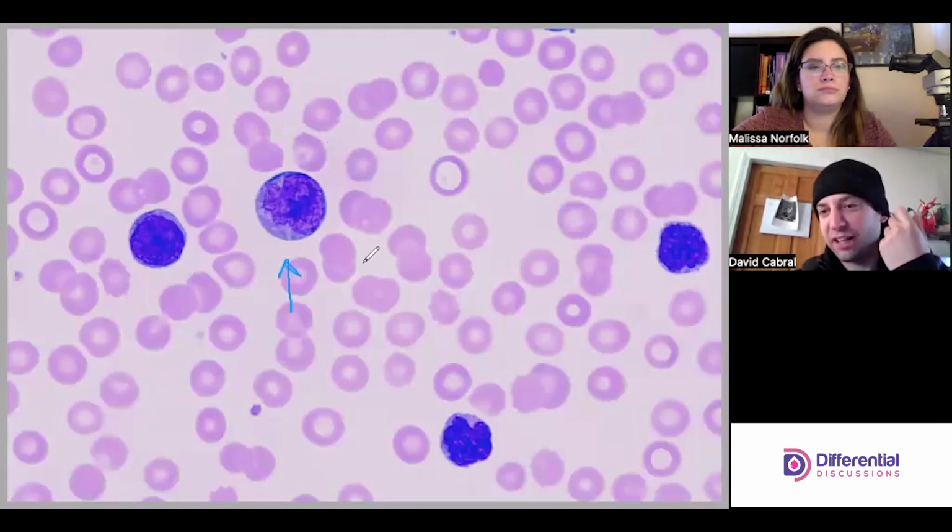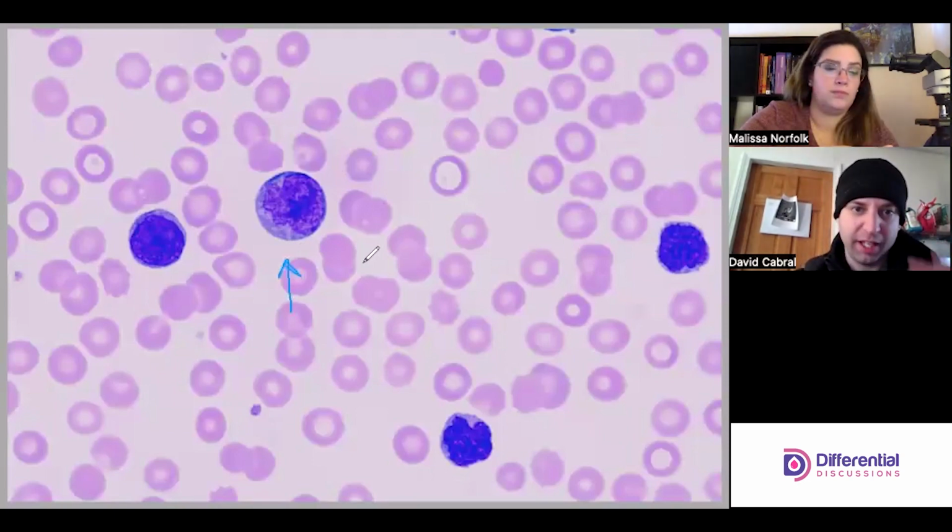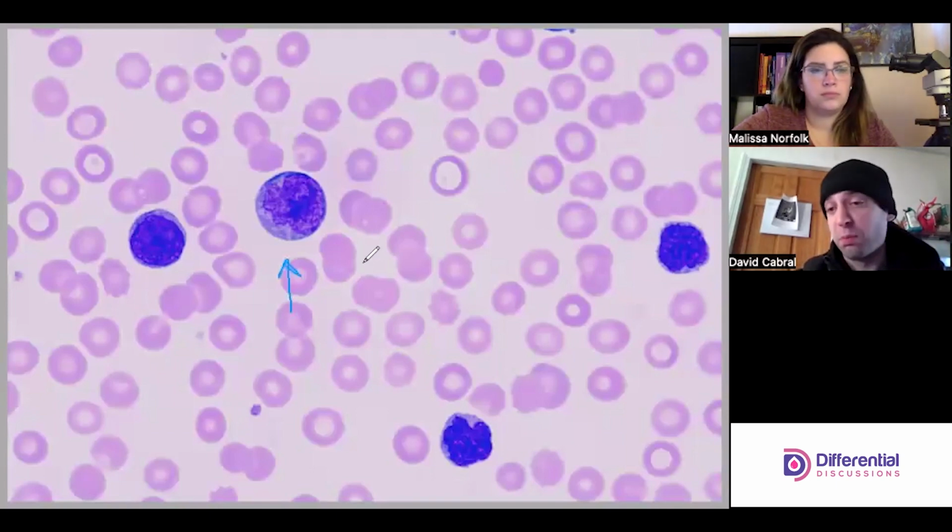It's like a broken record, right? But institution procedure, if the procedure itself calls for very specific things, because there's not a super prominent nucleoli here that I can see, but it's clearly not like a regular resting lymph. Right. And it's also not reactive, right? So it's you finding the right bucket to put it in. And it's not blasty.